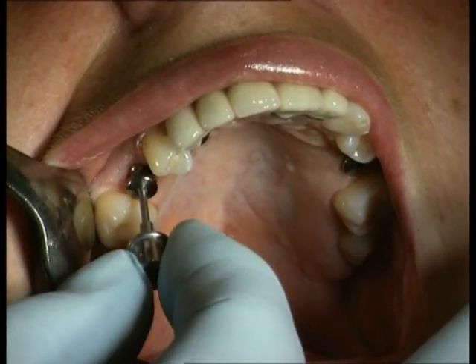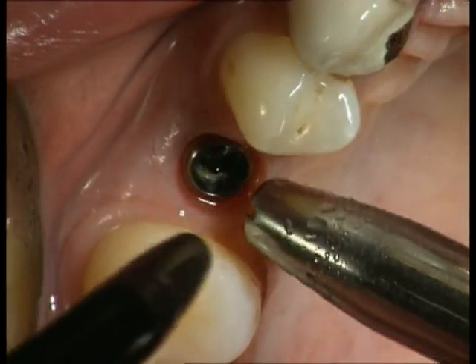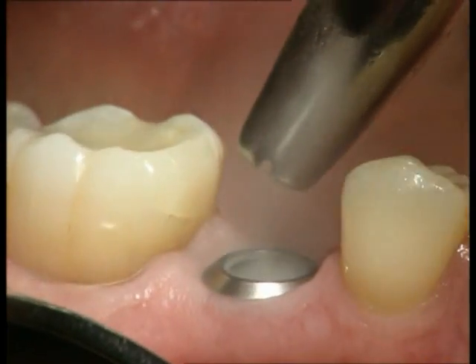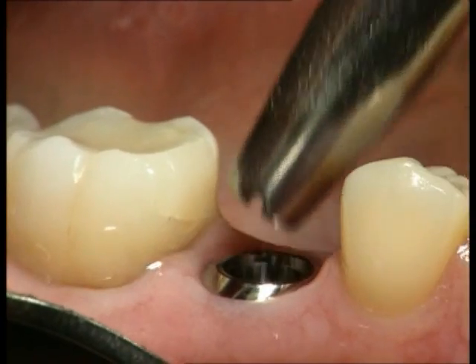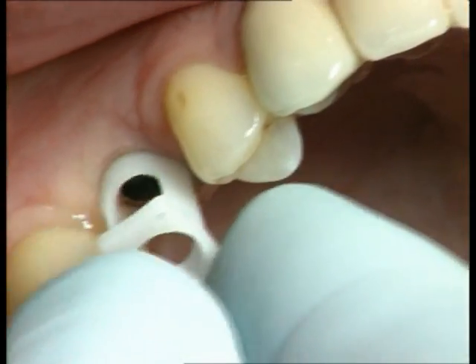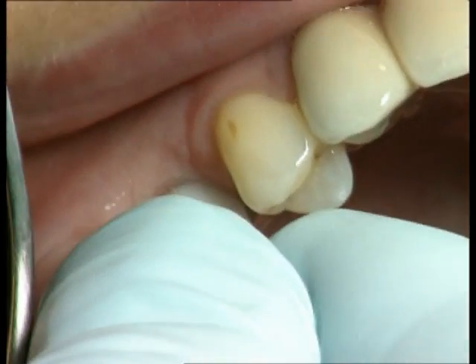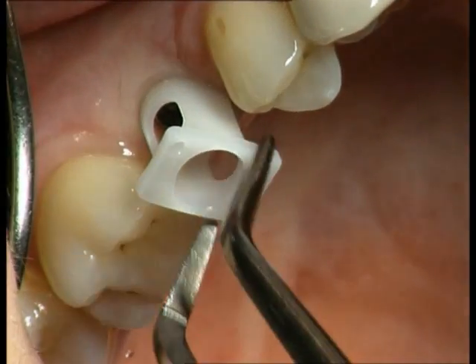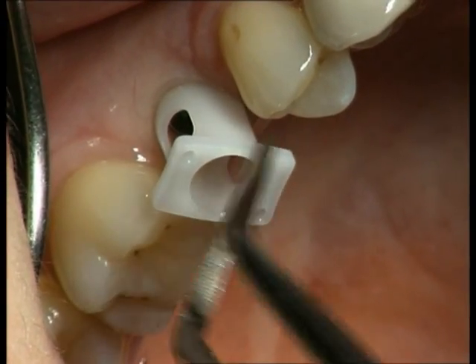For impression taking, the SCS healing caps are removed and the internal threadings of the implants are thoroughly cleaned and dried. Then the impression caps are placed on the respective implant shoulders and snapped firmly into place. The rotation test shows that the impression caps are securely positioned.